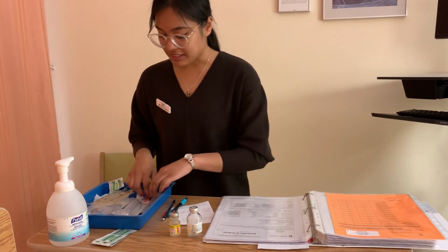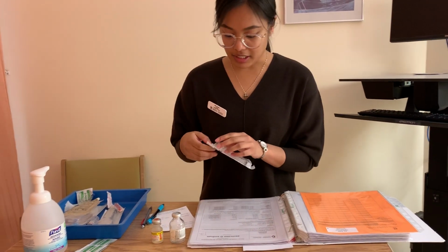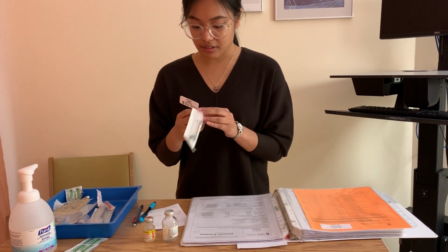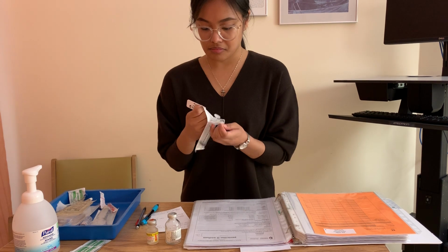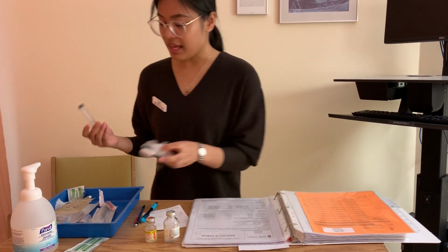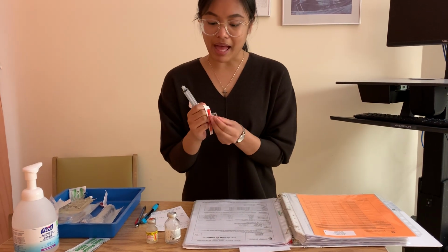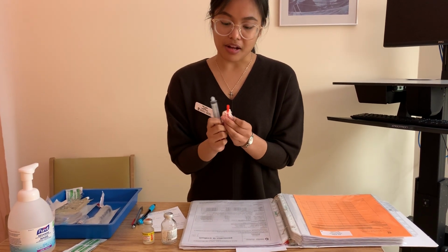And now I'm going to get my syringe ready. So I needed a 10 ml syringe for the 8.2 that I'm withdrawing. So I'm going to maintain sterile technique, ensuring that I'm not touching the ends. And I'm also going to use my blunt fill, bringing it back to make sure it's kept sterile.